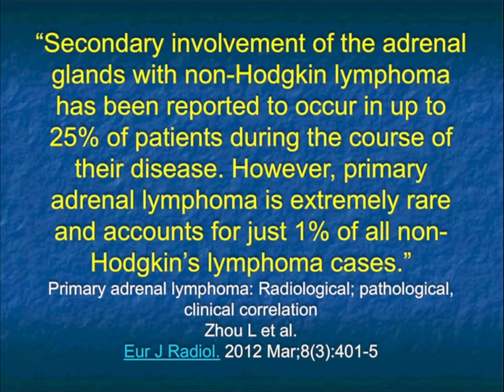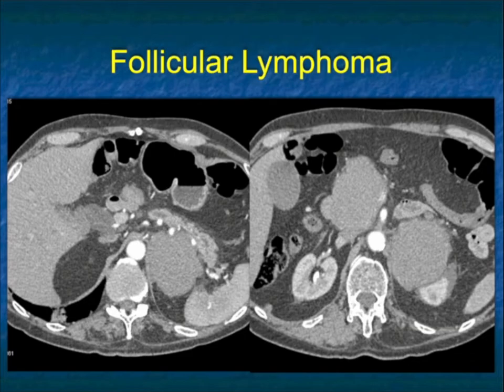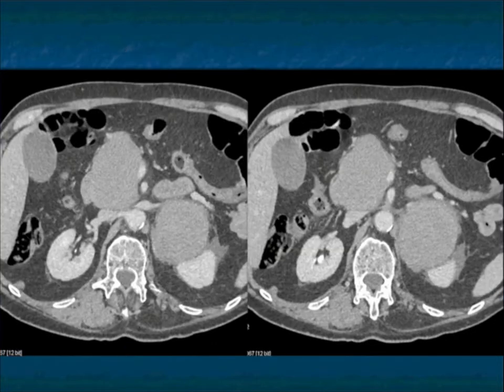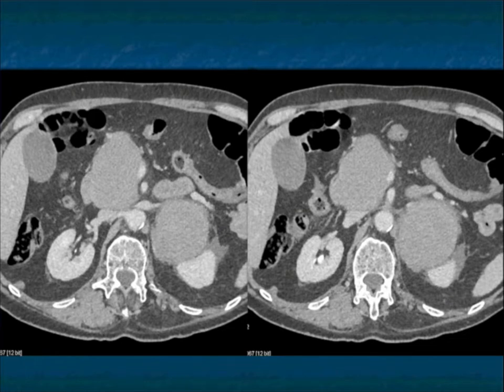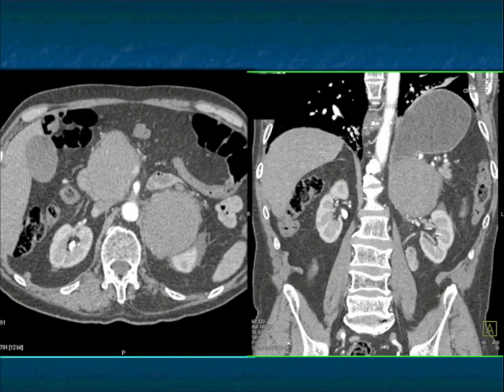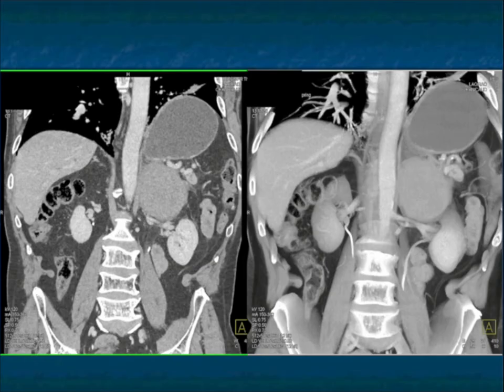Secondary involvement of the adrenal glands with non-Hodgkin's lymphoma occurs in up to a quarter of cases. Primary adrenal lymphoma is rare and accounts for just 1% of non-Hodgkin's lymphoma cases. Here's a great example of a patient who presented at the pancreas conference with a pancreatic mass, but then you see a large left adrenal mass. This ended up being lymphoma of the adrenal gland with nodal involvement in the peripancreatic region. If you only had the adrenal mass, you might think primary adrenal cortical carcinoma — but remember, that gives you nodes, but never such bulky nodes. So this was lymphoma, not a primary adrenal ACC.